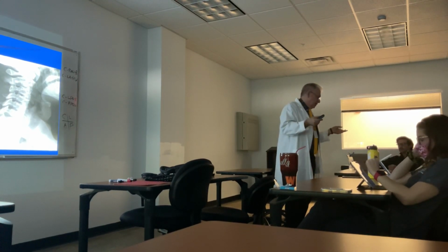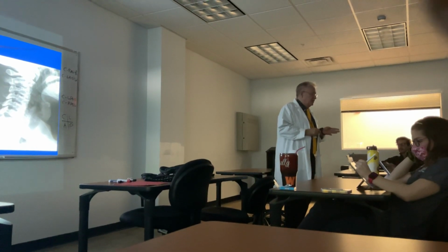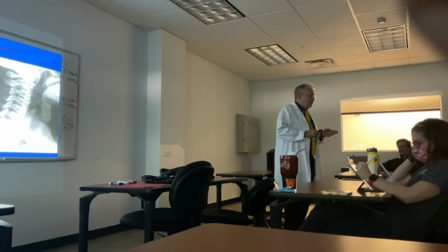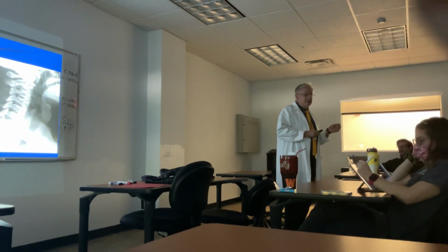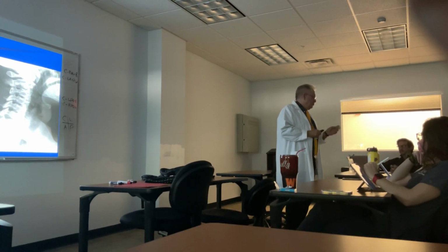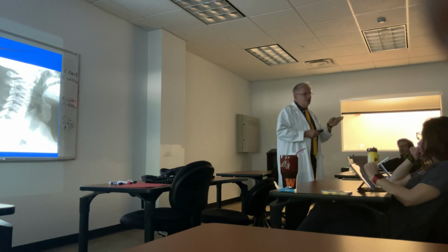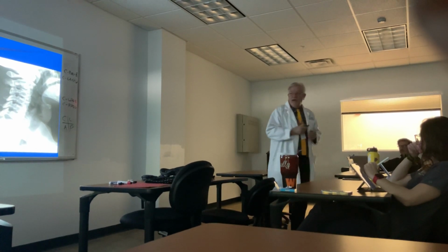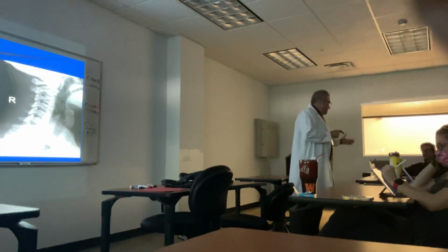Some of our colleagues out there in the real world don't want to take an AP open mouth view. Well, when your head hits the steering wheel, the vertebral body level that's most often injured is the second cervical vertebra, and it fractures. Are you telling me you have patients whose head hit the steering wheel? Yes. Should you be suspicious of fracture? Yes. So you're doing one less view because that makes you more certain? When the head hits the steering wheel, make sure you do the AP open mouth view. Now, we have a lateral to help us compare, but if the lateral is not very good, you're defaulting to the AP open mouth.